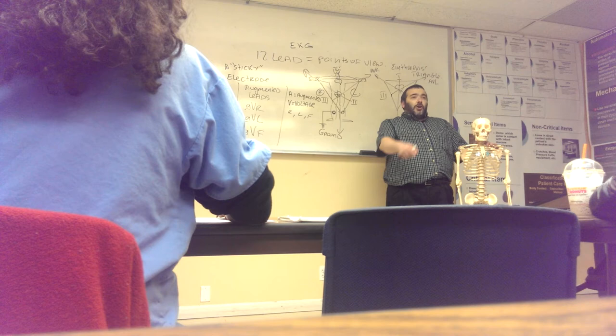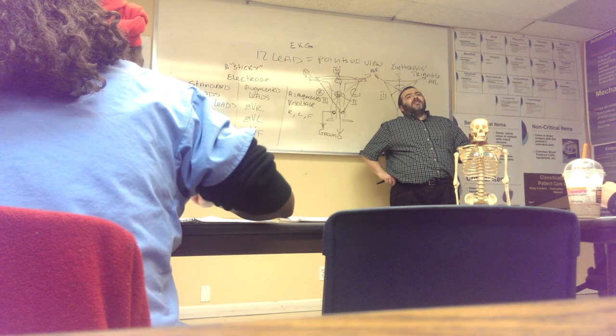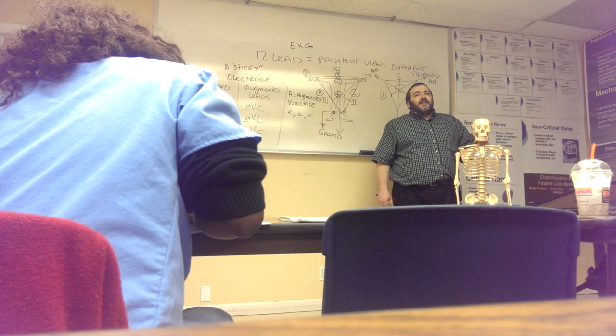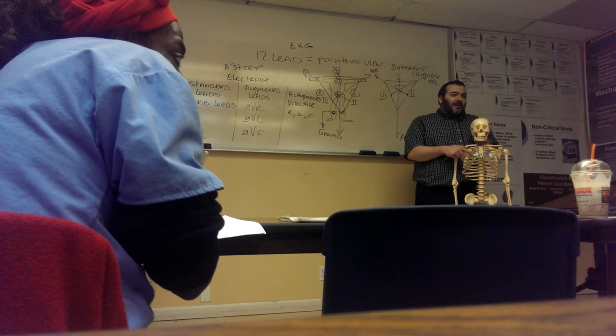If you turn back, you will see a picture of them. Big poster right at the EKG station right there. And by the way, these things are on the test also. You see those funny things marked with letter V, V1, V2, V3, V4, V5, V6, and you see the text next to them? The text next to them says where they are located. You need to know the text. Like, for example, V1 says it's located on the fourth intercostal space, on the right margin of the sternum.